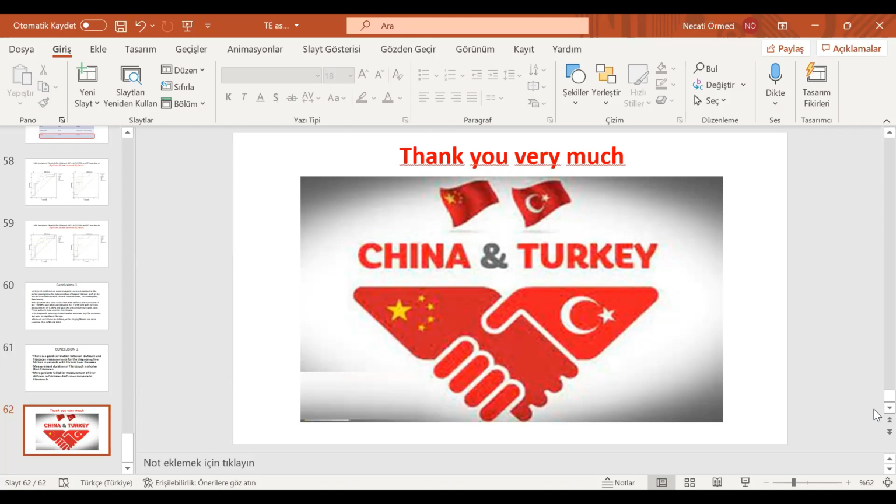In acute liver disease, such as acute hepatitis B or acute hepatitis C, generally, as we know, ALT levels are higher than 1,000. So in those patients, of course, liver stiffness measurement cannot be reliable. So we have to be careful to evaluate those kinds of results. We have to wait and follow the patients and then repeat, and then finally we can decide the real stiffness measurement. Thank you very much. I also agree with your opinion, because we need to wait and monitor during the inflammation activity stage.